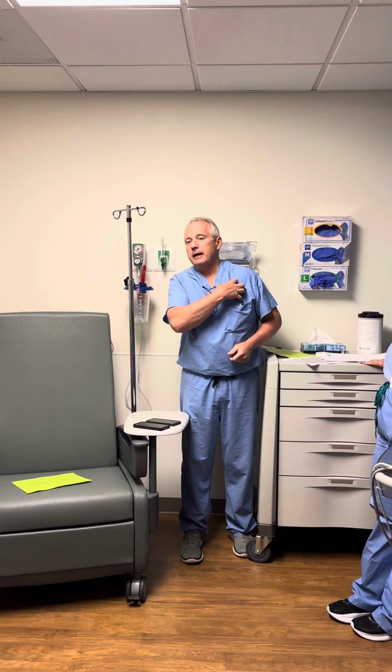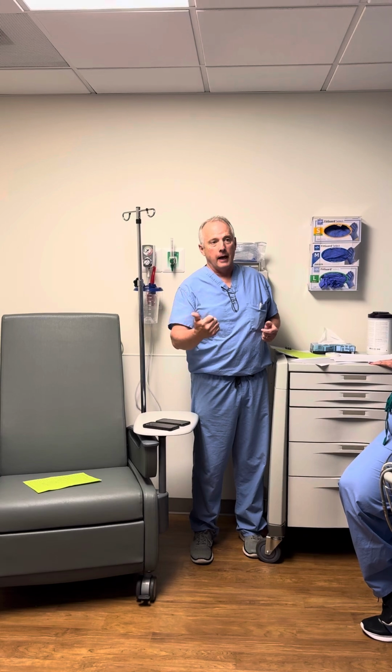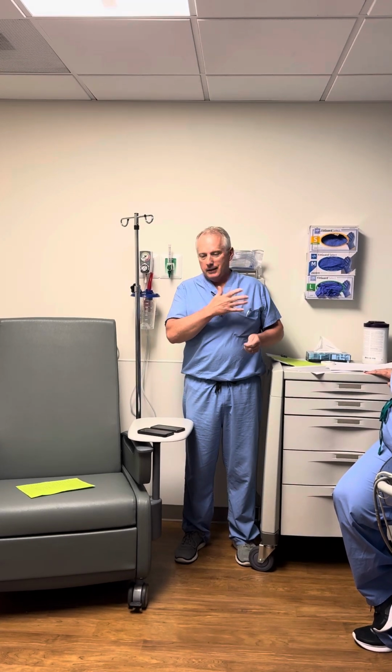A magnet response is how we sometimes determine whether the battery is near end of life or at end of life, or if it's okay, if we don't know anything about the device. All the manufacturers have their own rate specific to their company, but it's usually either 80, 90, or 100.